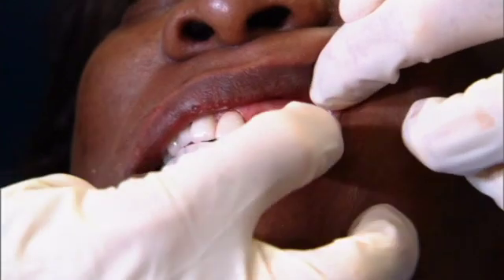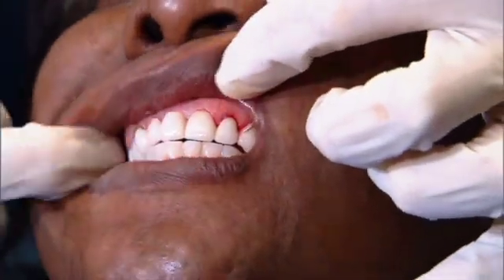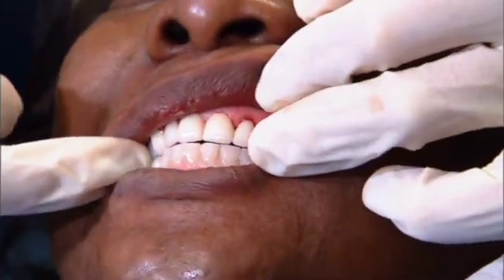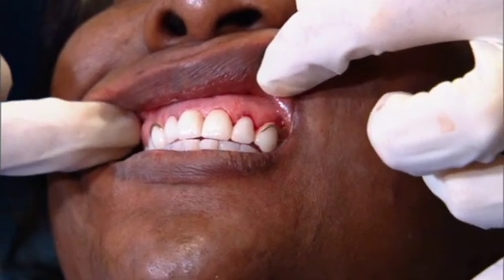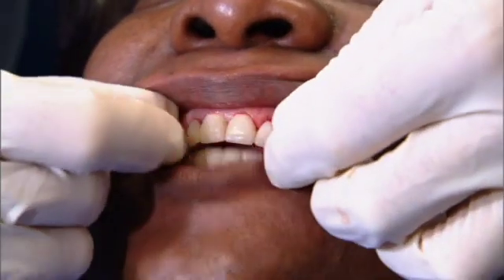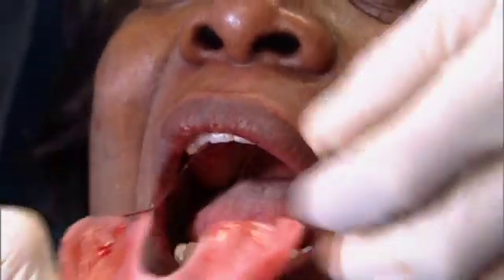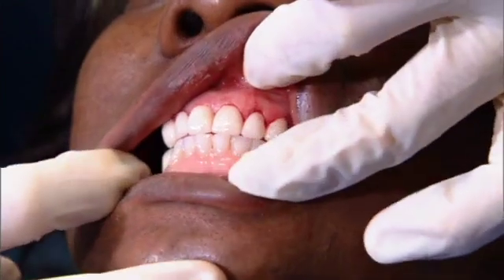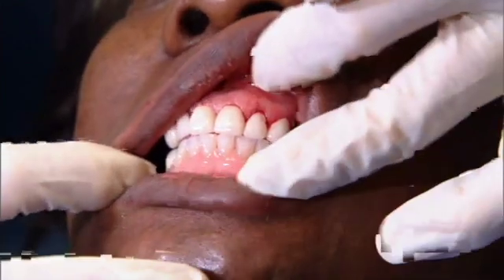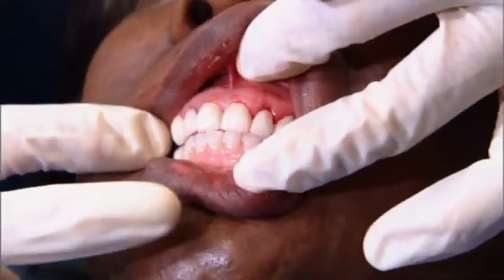The flanges are just in the right spot. But there again, I'm going to get her not to wear this for a couple of days because I want this area to heal where the implants were placed. If we slip out the temporary partial, now close on your back teeth again, you can see we got a pretty good color match and we're good and stable. All we can expect from this is really a good result. So we're good.